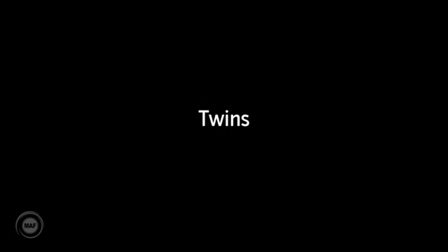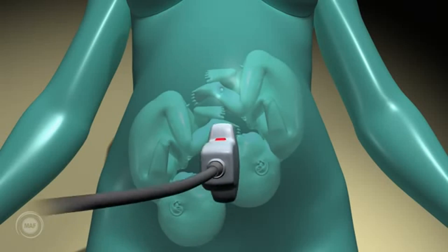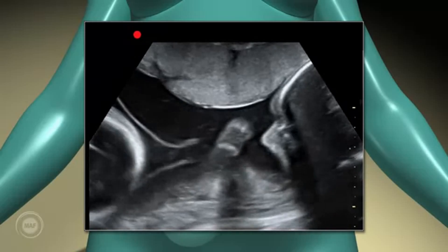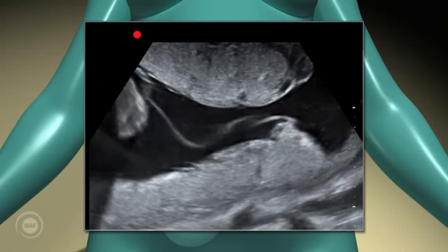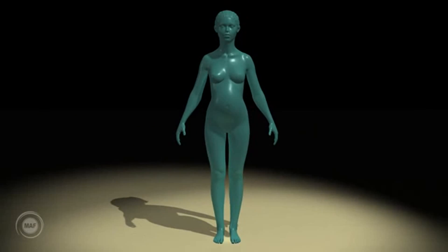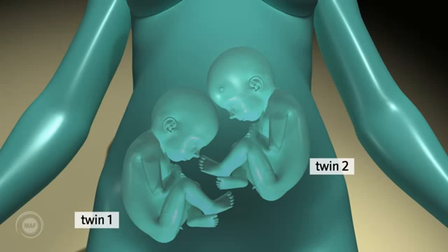Twins. During the ultrasound scan of twins, it's important to identify each twin and to describe their positioning. Twin 1 is traditionally referred to as the twin with the lower-most presenting part. In the case where both are lying longitudinally with a cephalic presentation, twin 1 will be the twin that has its head lowest in the pelvis. In the case of breech twins, the same principle applies — the twin with the lowest-most breech will be described as twin 1.